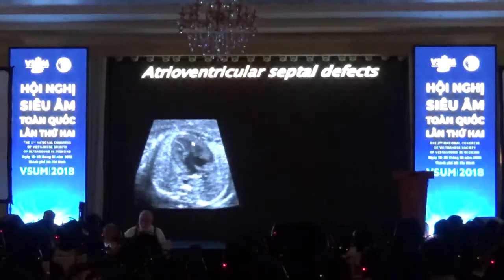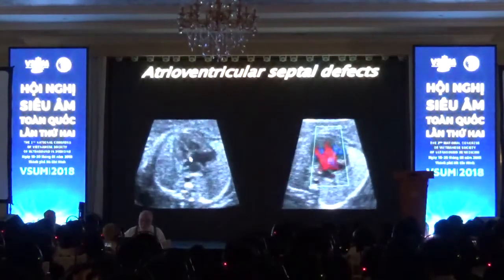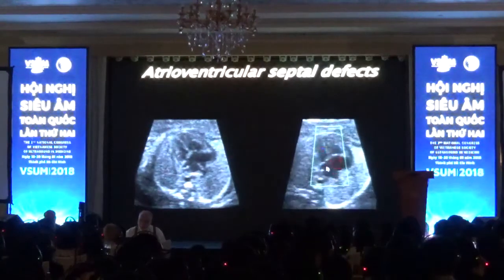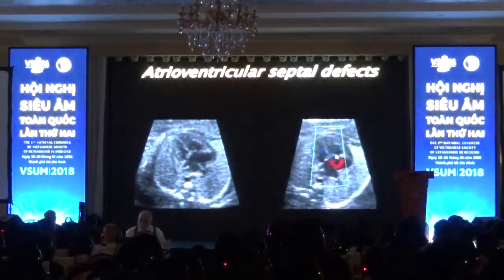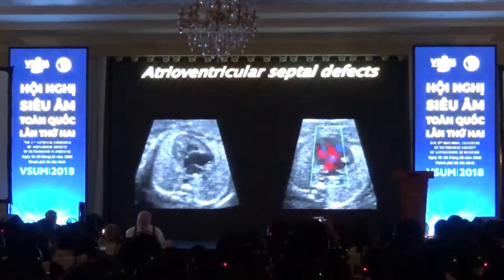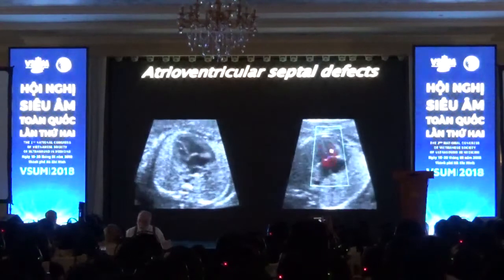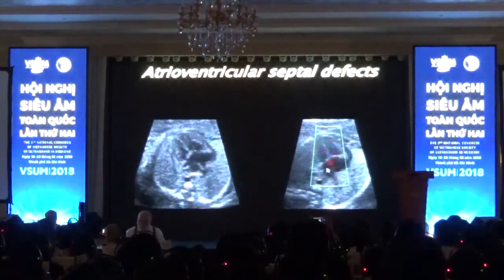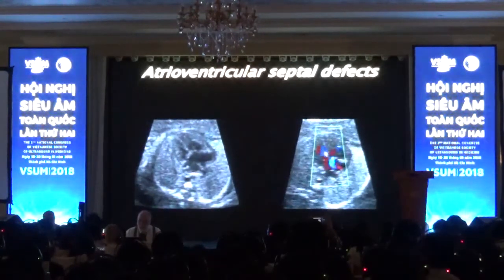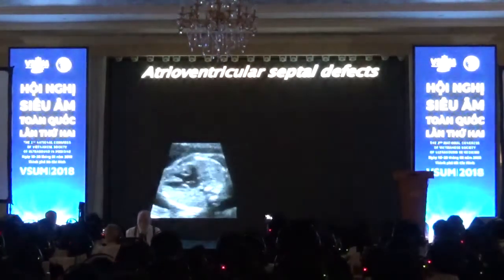So here we go into the four-chamber. You can see this big bridging gap on both sides, and you see the classical image of this inflow that looks like a Y into the two ventricles at the same time. You see this during diastole, flow enters from both atria to both ventricles at the same time with this division at this level.